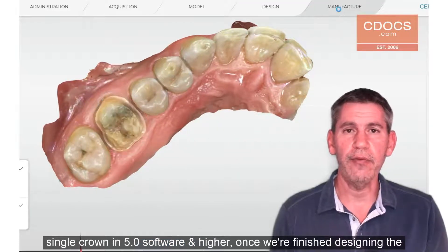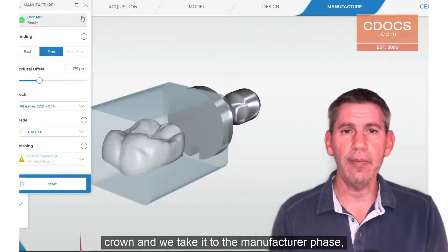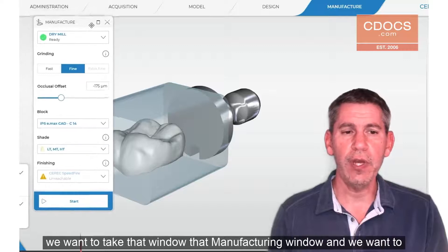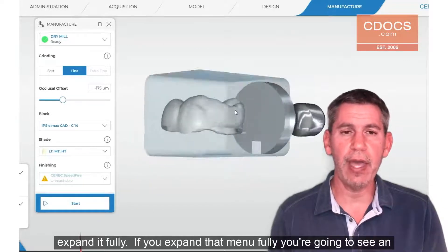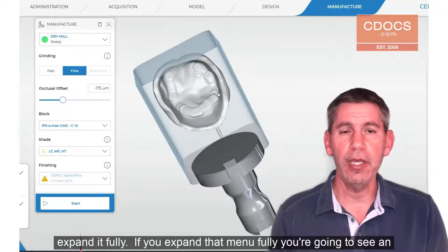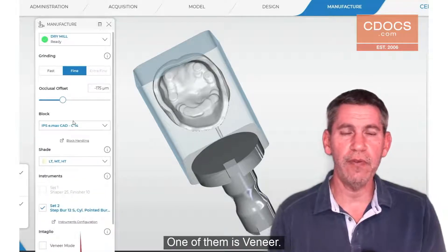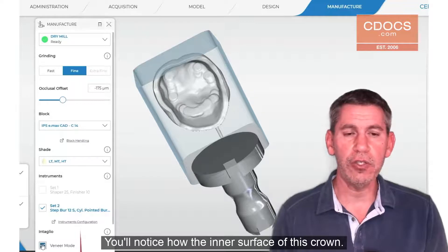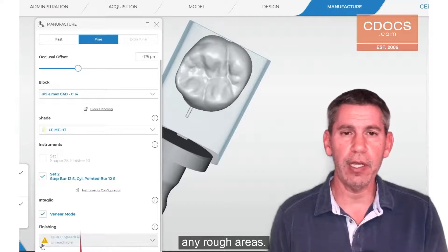Once we're finished designing the crown and we take it to the manufacturer phase, we want to take that manufacturing window and expand it fully. When you expand that menu fully, you're going to see an option for milling modes. One of them is veneer. You'll notice how the inner surface of this crown looks like it's been calculated with over milling to compensate for any rough areas.